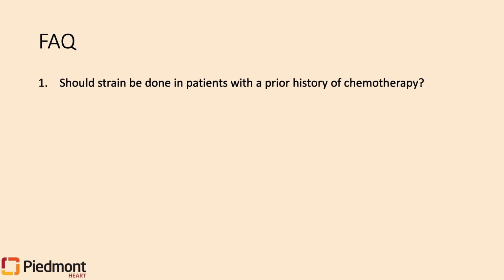Now let's review some questions that have been brought up. Should strain be done in patients with a prior history of chemotherapy? That's a good question. What we discussed was performing strain on any patient who is about to start chemotherapy or undergoing chemotherapy. That is quite important because that is the patient that we can probably do the most good for in terms of surveillance.